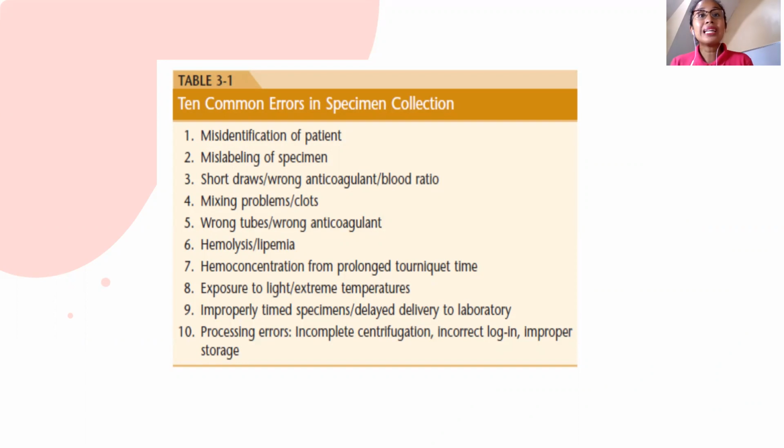We have improperly timed specimen. So, example, fasting. So, class, fasting should only last from 8 to 12 hours. 8 to 12 hours. So, anything more than that, guys, it's over fasting. So, actually, hindi na yun tama. However, class, literature says that cholesterol testing, yung lipid profile testing, it could be tested for 8 to 14 hours yung fasting. 8 to 14 hours. Pero pag glucose, 12 hours lang. So yan, 10, processing errors, incomplete centrifugation, incorrect login, improper storage.